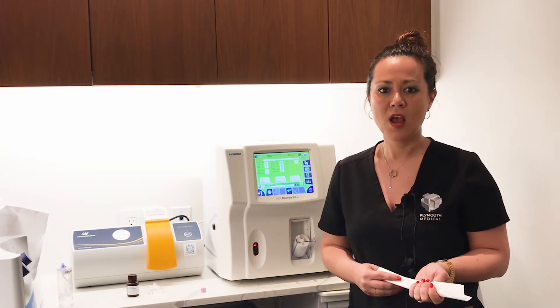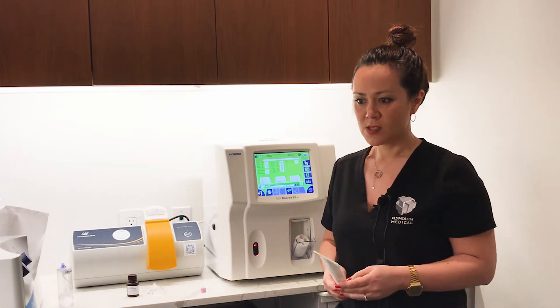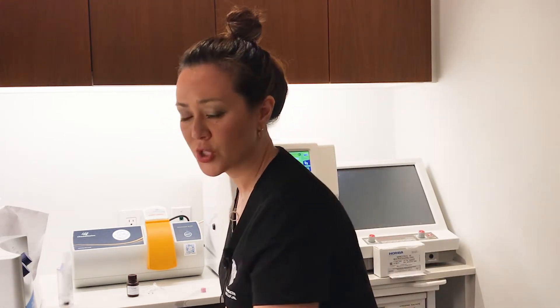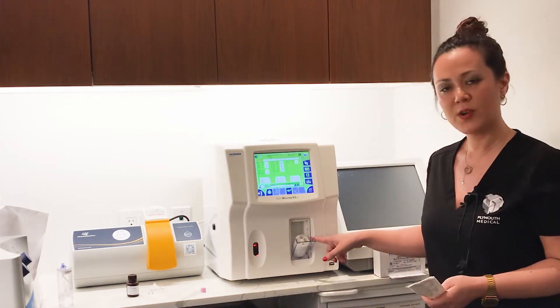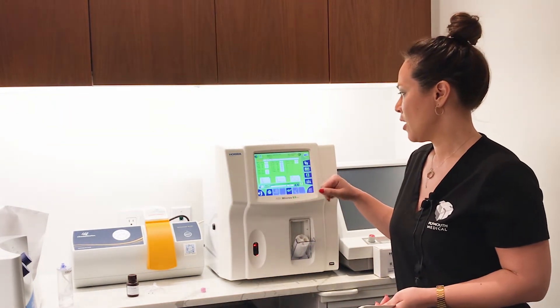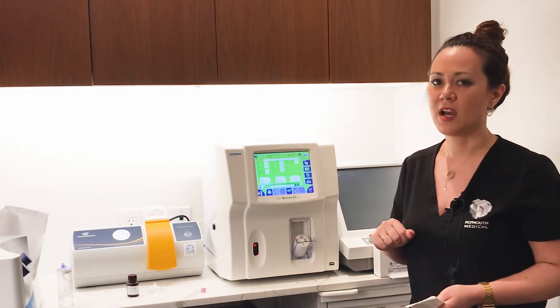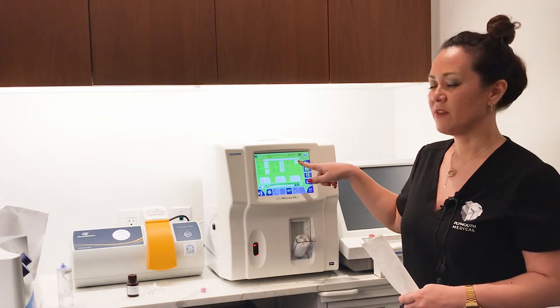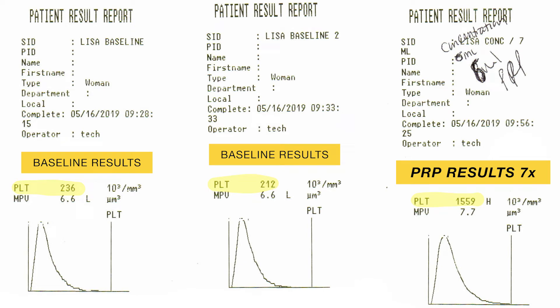We're actually treating a smaller joint today, so we created 6 mLs of PRP. We then took a couple of drops of this PRP into our microtainer sample, and you'll see that the final platelet value here is 1,559. So we took 1,559 divided by 220 on average, and found a seven-time baseline increase over the patient's baseline values.